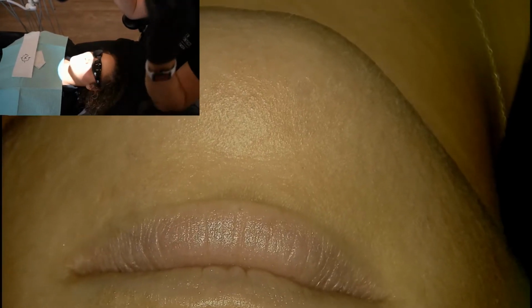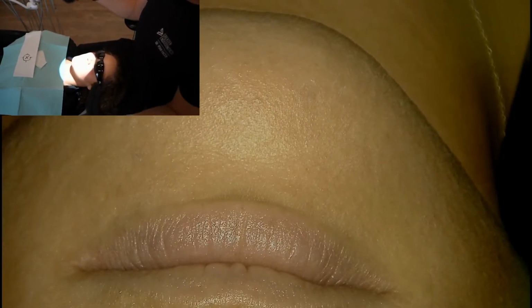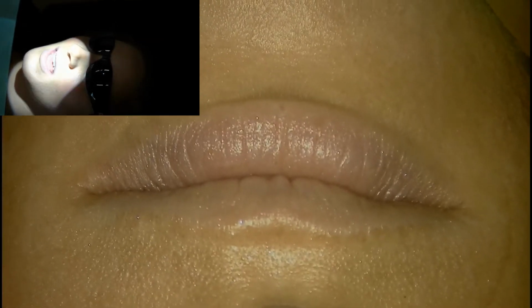And this is about 400, 450, which is very, very tall. And I couldn't work in that environment at that length here. I can get this back in focus for video documentation, but I certainly couldn't look in the microscope without sort of arching my back and expanding my rib cage to kind of stretch, which would be very uncomfortable. So you really want to know your comfortable length, and I'm about 300. I'll stretch to 350 at times, and I can put her in focus, and this is my working environment.